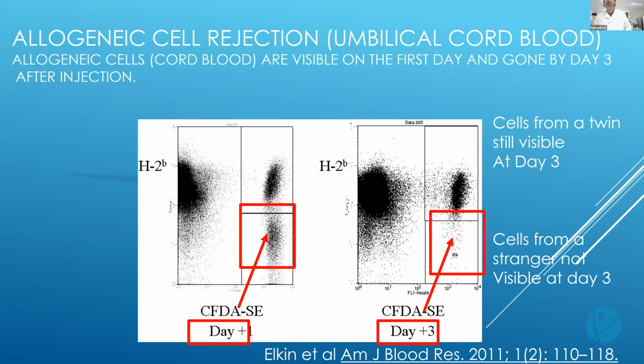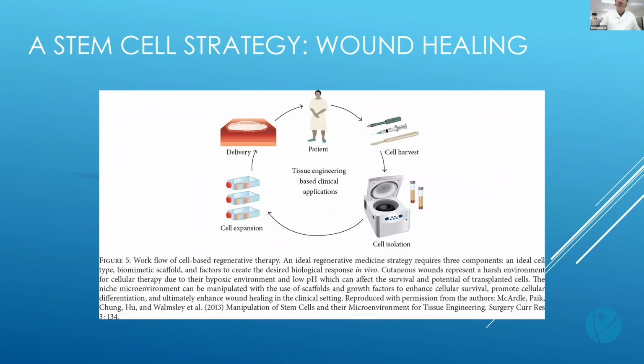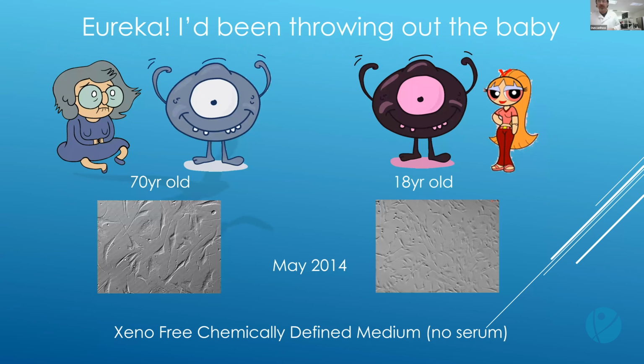So for those reasons, I wanted to avoid that and try to grow the patient's own cells up to, like I said, 7 million cells. So I started doing that, and I started having some really nice outcomes. Now, I started to run into trouble, though, once in a while. Generally, I would take out stromal vascular fraction, and I could grow it in this very expensive xeno-free chemically defined medium. It's 10 times more expensive than if I used human serum or cow serum. There's nothing in it besides chemicals, growth factors, rather.